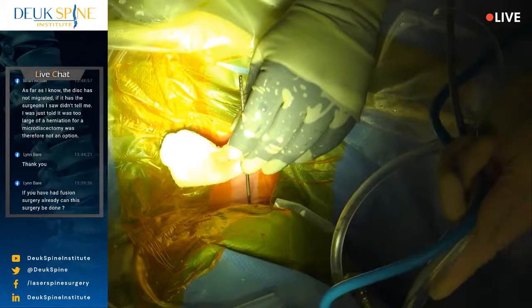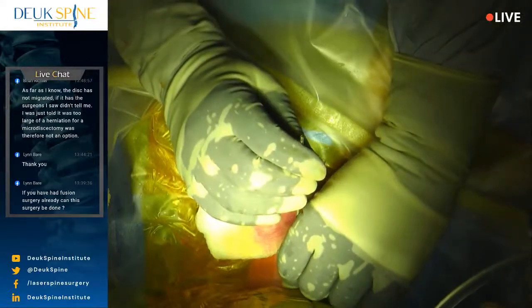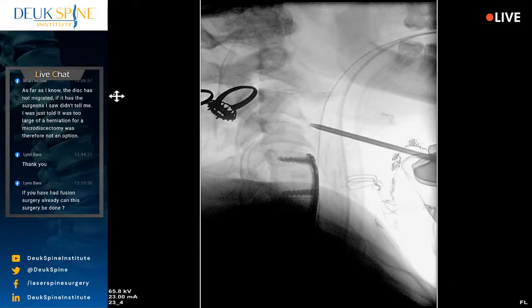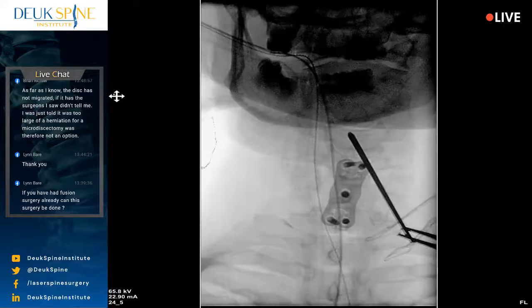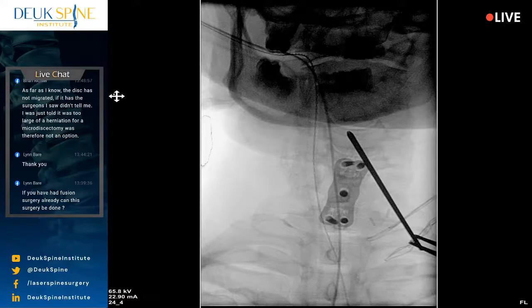So I'm going to use AP and lateral views. You're too high. You're way too high. All right. I'm going to go a little bit further. Shot. Shot. That's perfect. AP. So I'm now over the next disc, and I'm going to get another shot just to make sure that I'm not off the spine in the midline. I want to be in the middle of the spine. That looks pretty good. Let me move it a little bit towards me. That feels really good right there. Don't move anybody. Shot. That's a little too much. See that shot? That's a little too much.